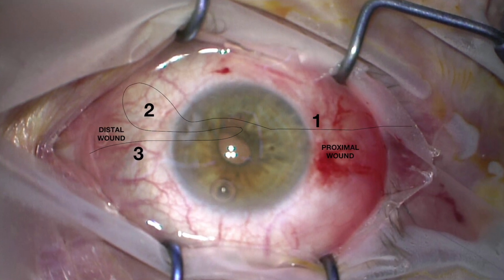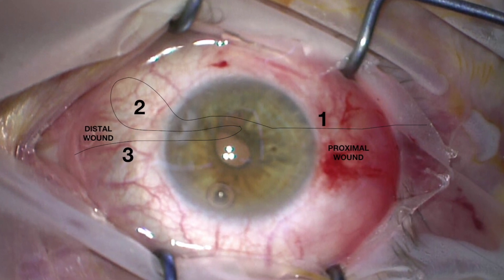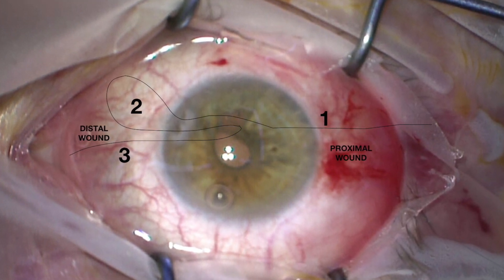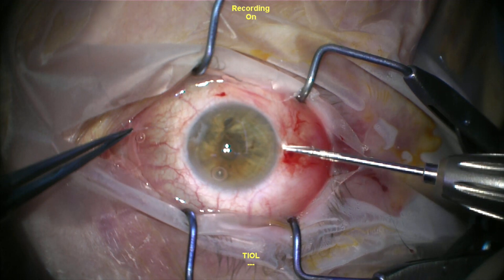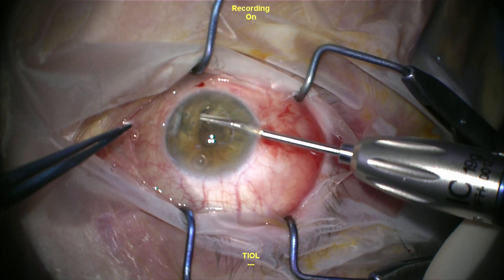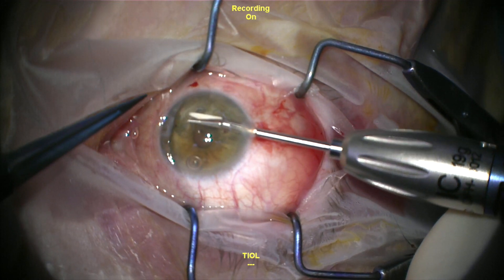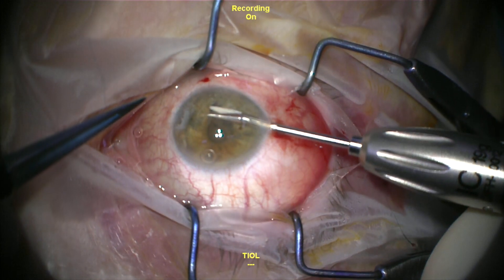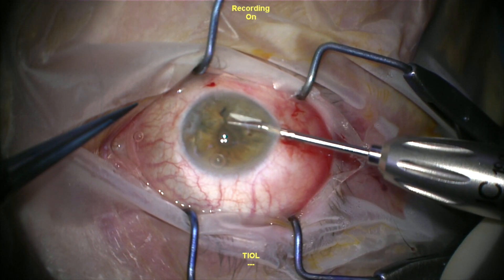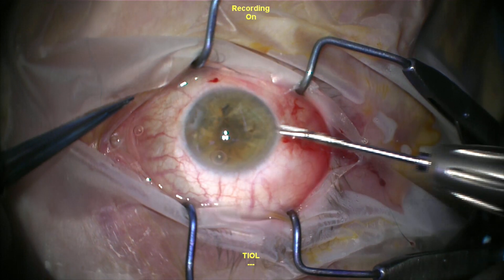That same procedure is repeated two more times, but instead of three loops around part two of the suture, one loop is performed and then pulled through the proximal part of the wound. I'm using micro scissors to cut the suture very close to the knot so that there aren't loose ends inside the anterior chamber that could chafe or cause irritation to the corneal endothelium, and I'll perform irrigation aspiration.